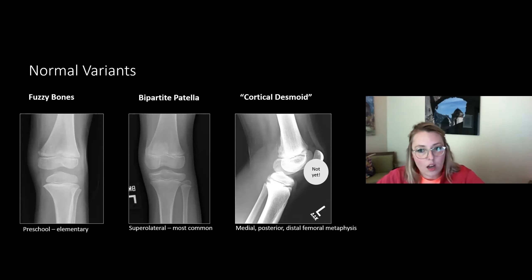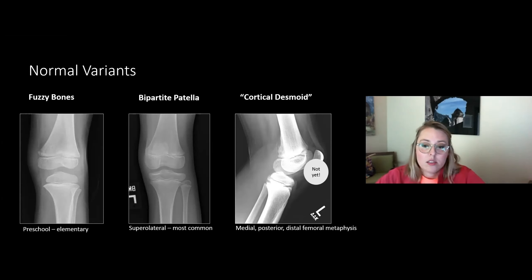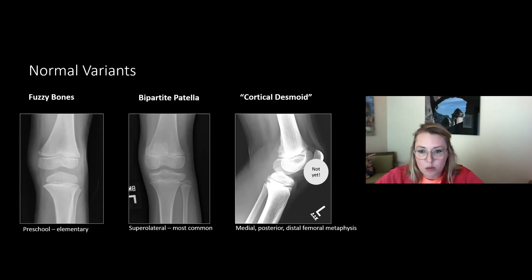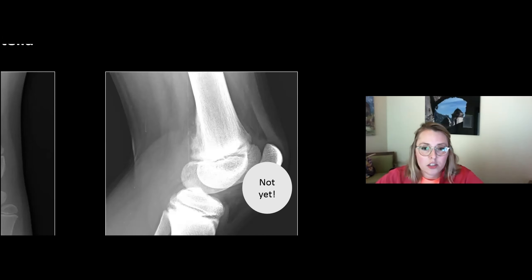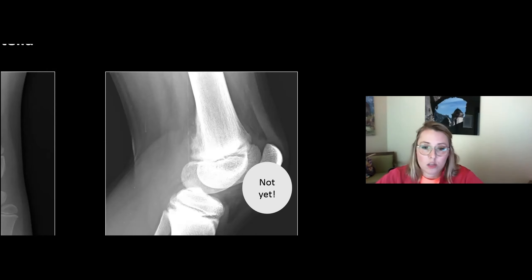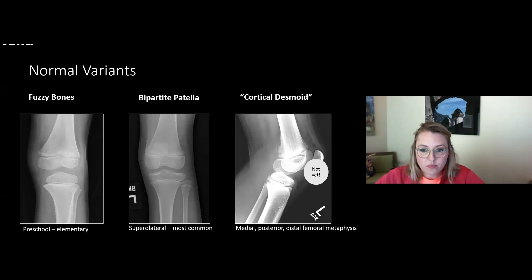The cortical desmoid deserves special mention because you'll hear it in x-ray reports and it sounds like — and can even look like — a terrible bone tumor out of context. It's located at the posterior distal medial femoral condyle, where the medial gastrocnemius originates, which constantly pulls on the bone causing remodeling and irregularity. It is completely asymptomatic, does not cause problems, does not need follow-up or MRI, and is not the reason their knee hurts. Cortical desmoid sounds scary — nothing to worry about.